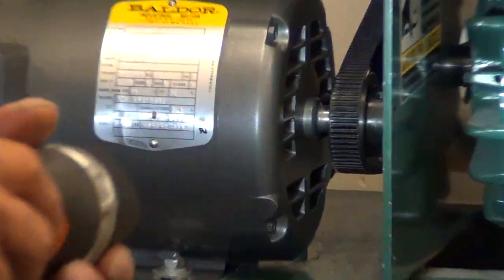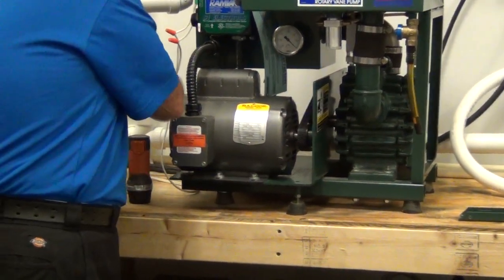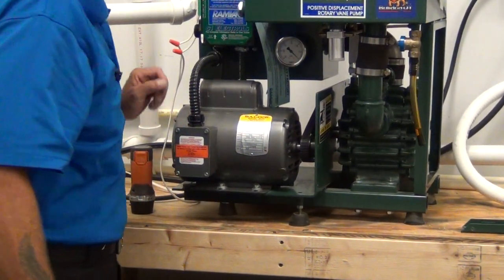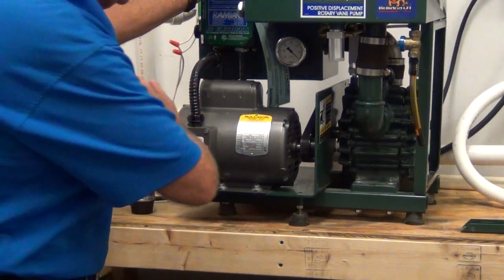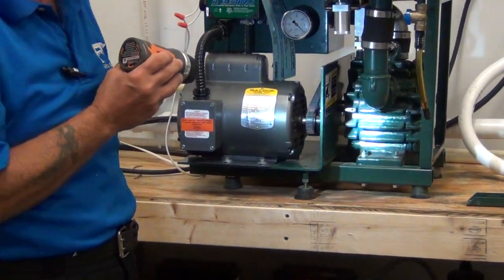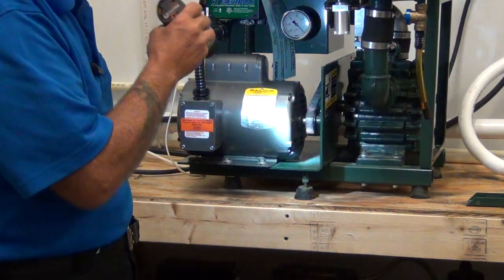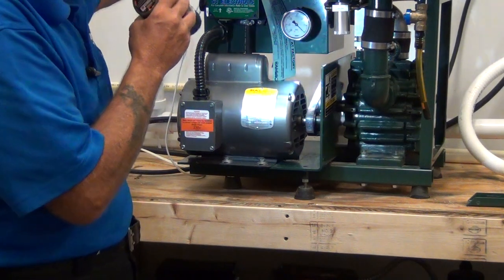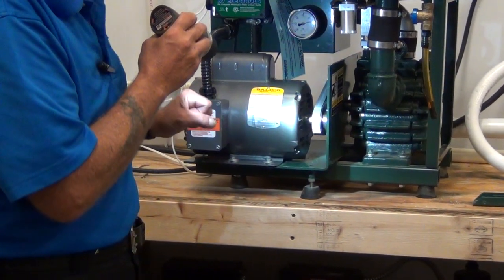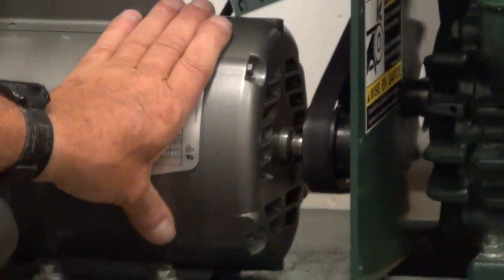Now we're going to plug the machine back in and make sure the belt's not flopping — it's running concentrically. Plug the machine back in, taking care; you're going to be in some dark, dank circumstances doing this, and it's going to be very hot. So use your flashlight, look all around, make sure no tools are left around moving parts, make sure your fingers are clear, and we're going to start up. The belt looks fine. No flopping. No loss of torque during the power transfer from the motor to the turbine.